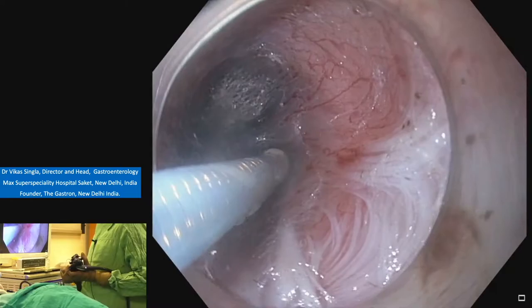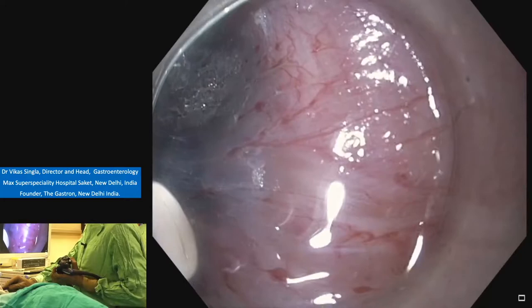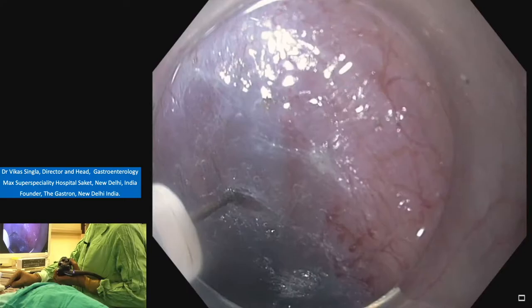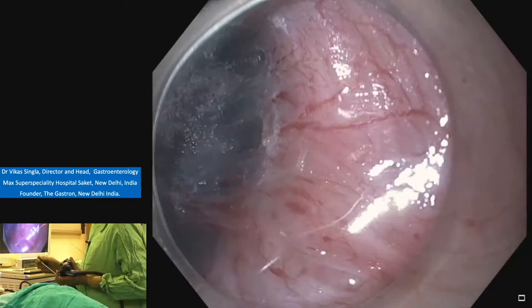Now we can see there is some change in the vessel caliber, and now the vessel has also become large and spindle shaped. It means we are entering the gastric side. Here suddenly the vessel density changes. You feel a load of vessels once you are on the gastric side. And we should be doing 2 or 3 cm tunneling on the right side. So on the gastric side, the tunnel length should be around 2 to 3 cm.